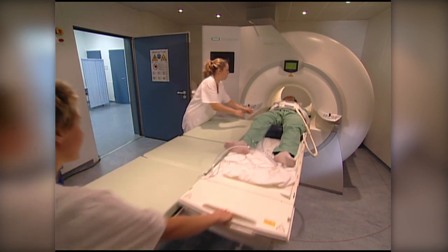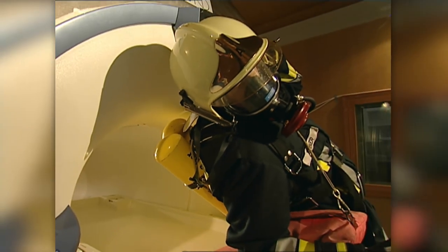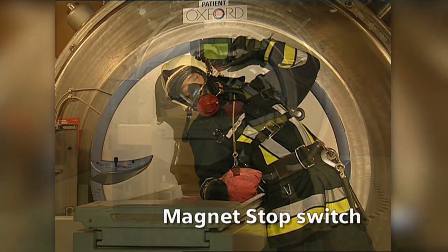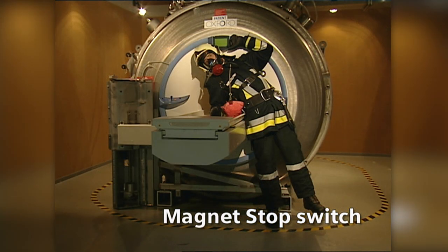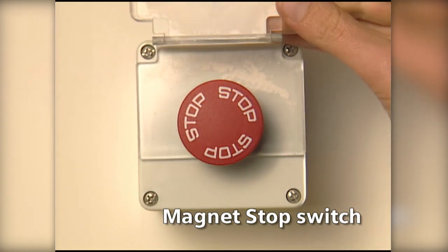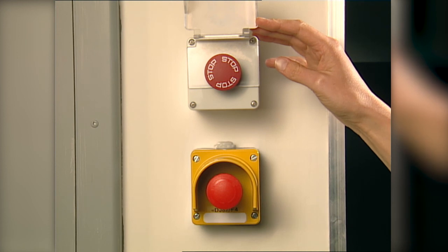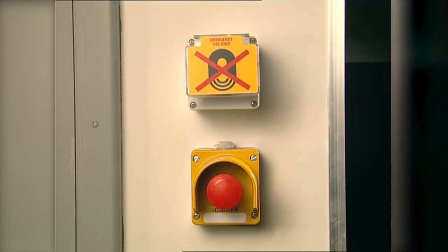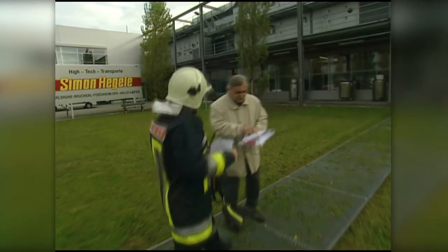In the case of an extreme emergency, presenting risk of bodily harm and death, press the magnet stop switch immediately. The field strength rapidly decreases to a low value. This does not apply to permanent magnets. In this example, the magnet stop switch is above the emergency shutdown switch and is differentiated from it by the magnetic field label. Time saves lives.